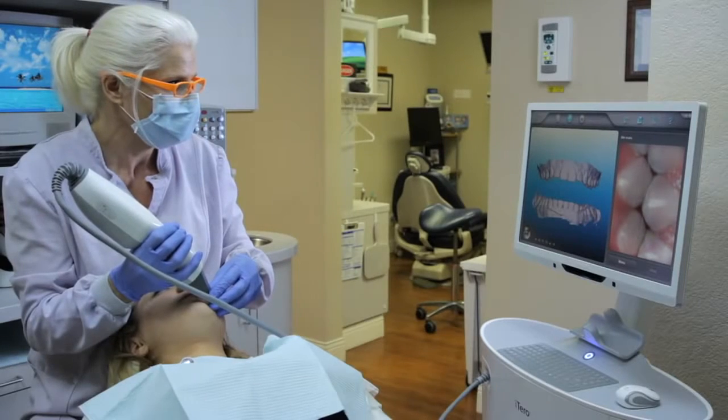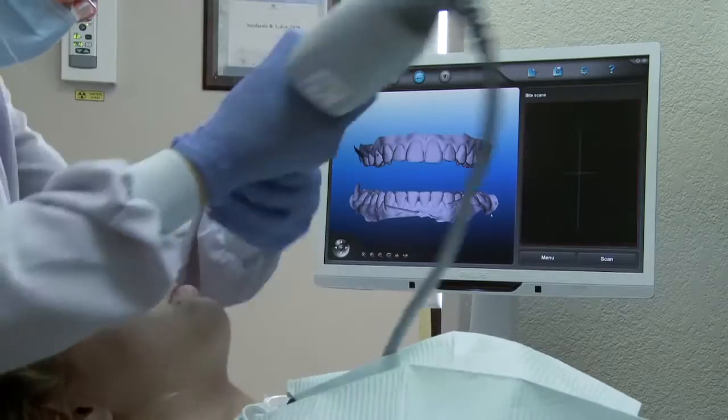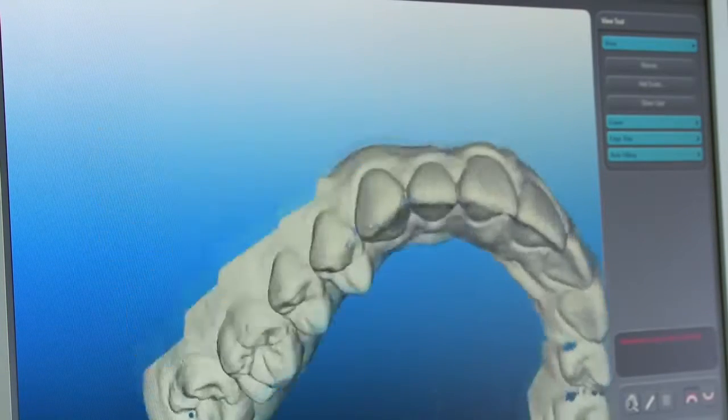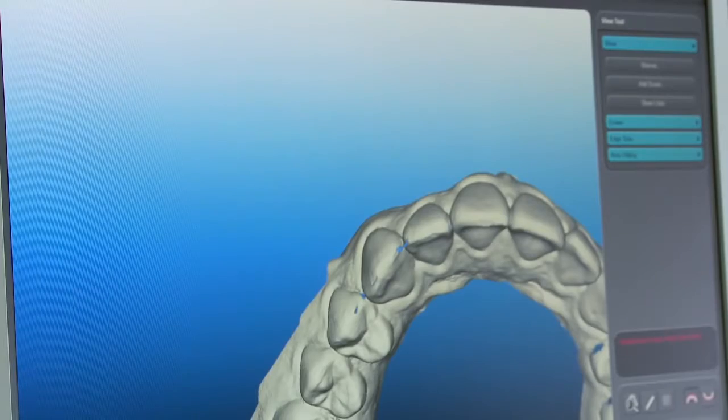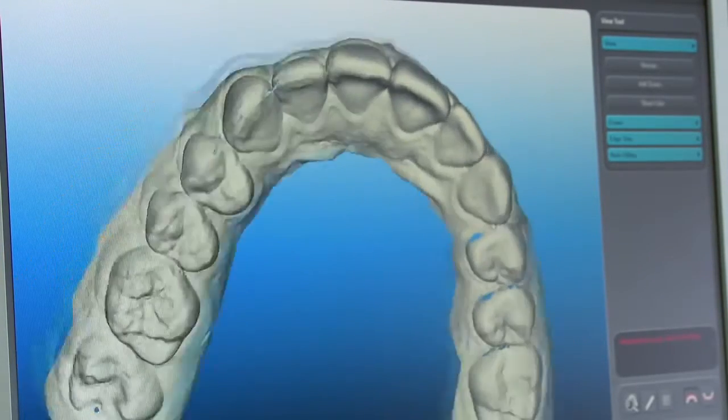After all quadrants are scanned, a bite scan is performed to accurately capture the patient's occlusion. The model is inspected, and if any areas of incomplete data are found, additional scans can be added easily to complete the impression before the patient leaves the chair.